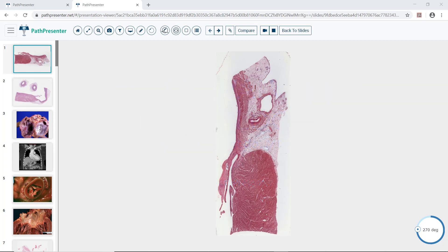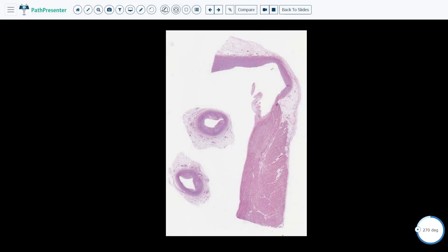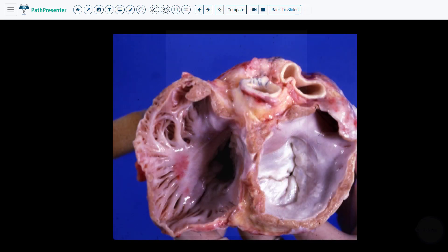The first case is a normal mitral valve and is reviewed in a separate video. The second slide is a normal aortic valve and is also reviewed in a separate video. The third slide is a photograph of a normal right and left atria. The purpose of this slide is to learn the differences in the appearances of the right and left atria so that when you are looking at gross photographs of the heart, this will help you identify which side you are looking at.